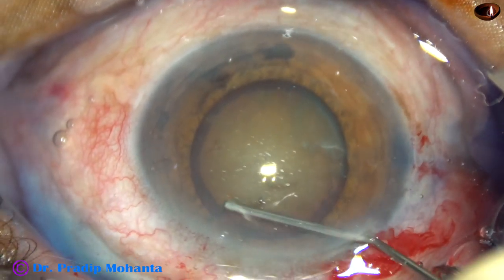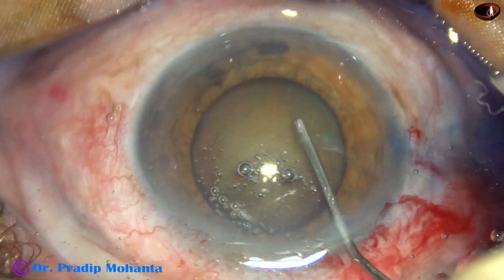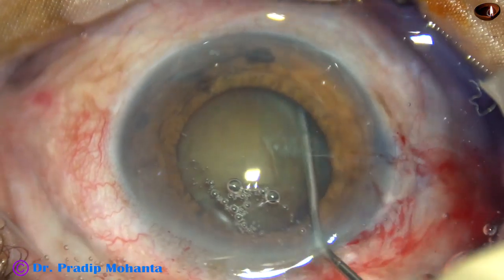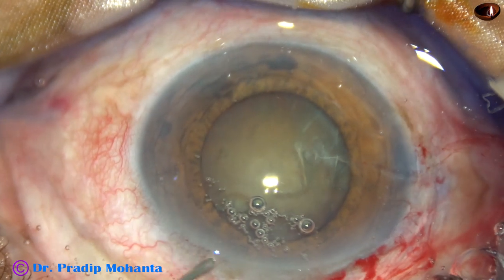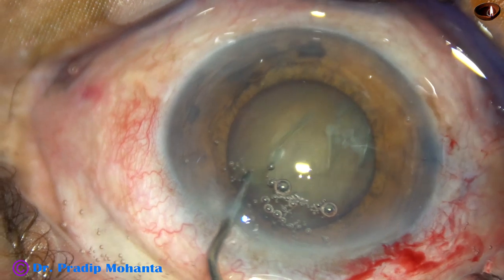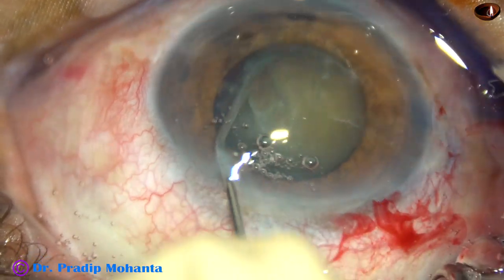Now hydrodissection is done. There are some air bubbles in the syringe — they have come out. Since this is a hard cataract, fluid is injected at multiple points. And then the nucleus is mobilized.